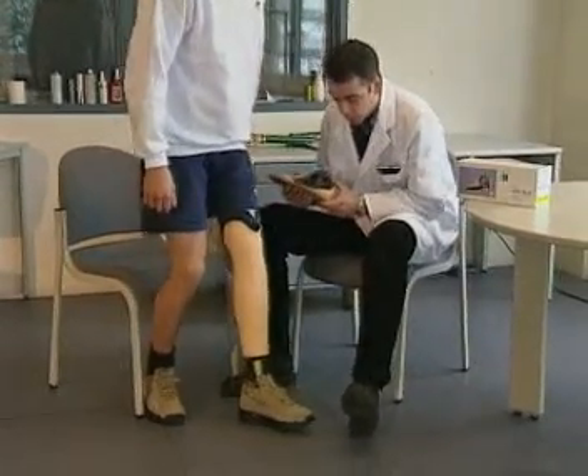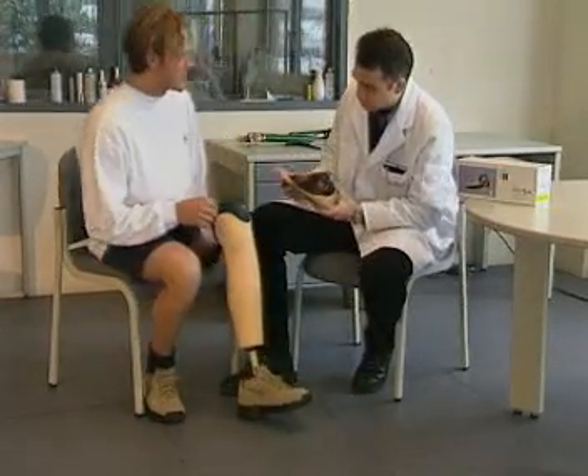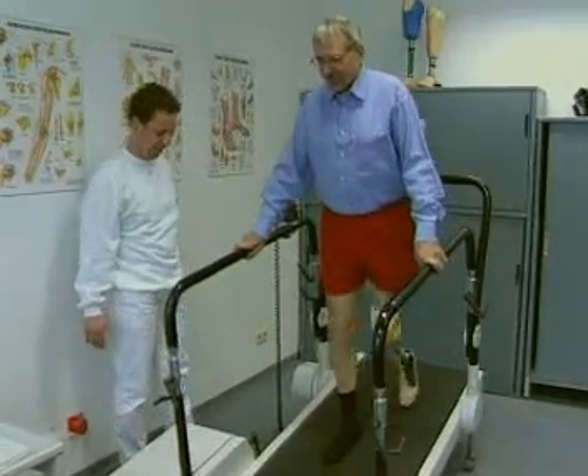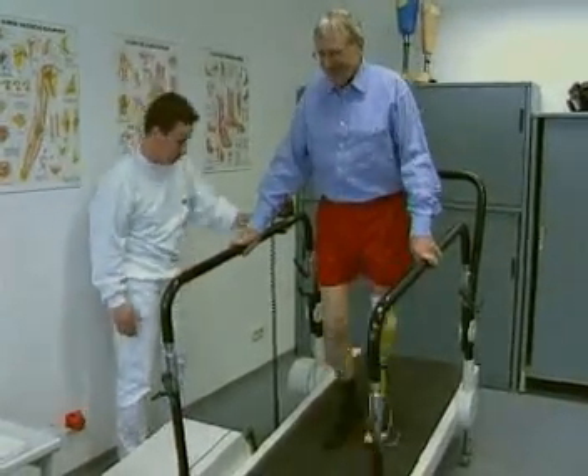Patients like the dynamic resistance of the variable rate forefoot spring, which has been designed to provide optimal function suitable for a broad range of activities and loading.